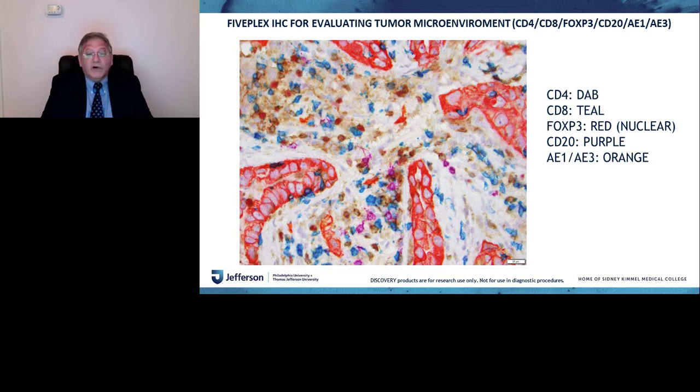The good thing about this, though, is that this is a constant thing. That means it is not sometimes going to be yellow and sometimes orange. It's always an orange color if you put it first. So for purposes of quantifying, it doesn't really matter. So these were examples of research applications for the multiplex with chromogenic immunohistochemistry.